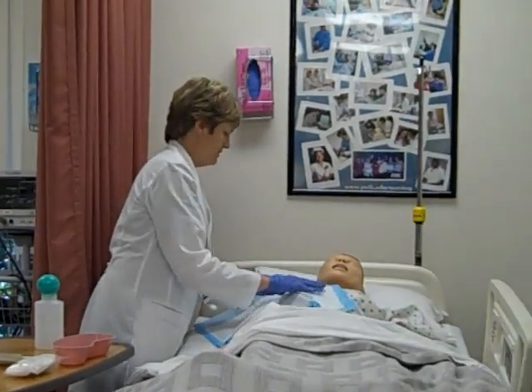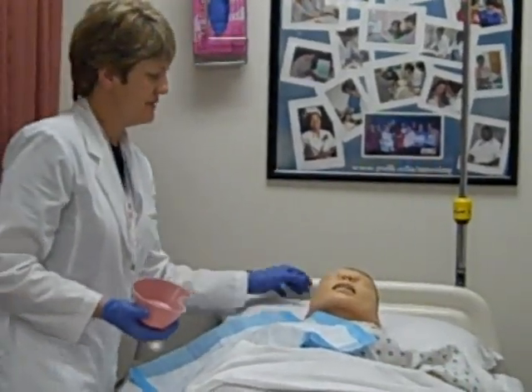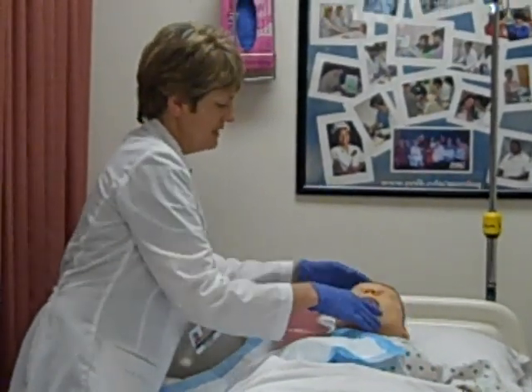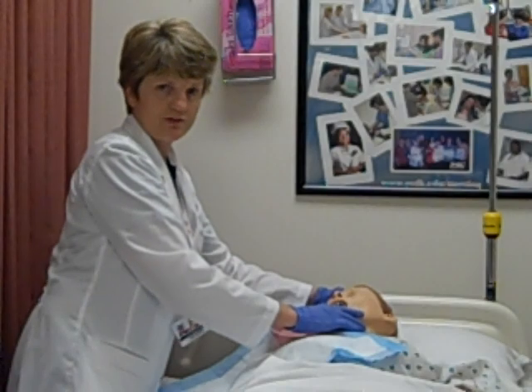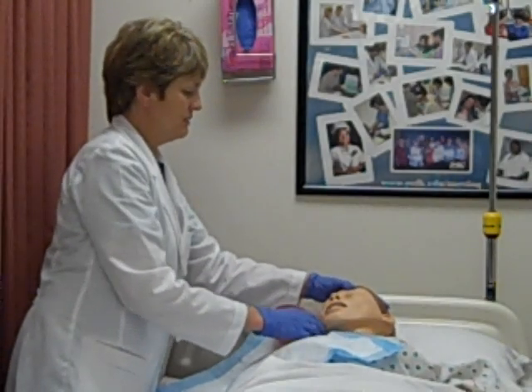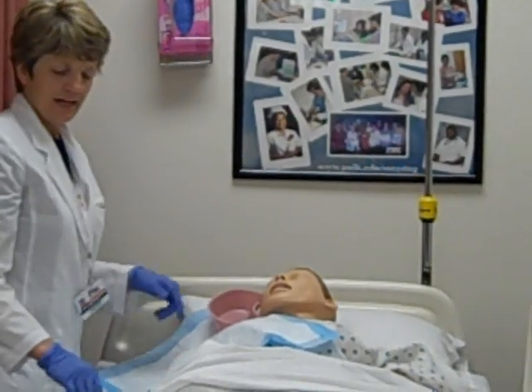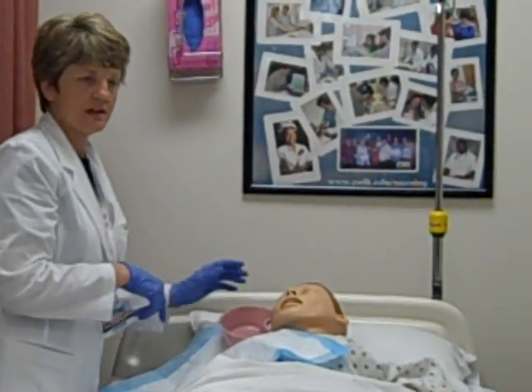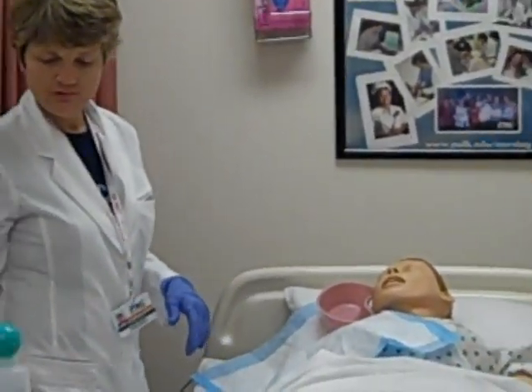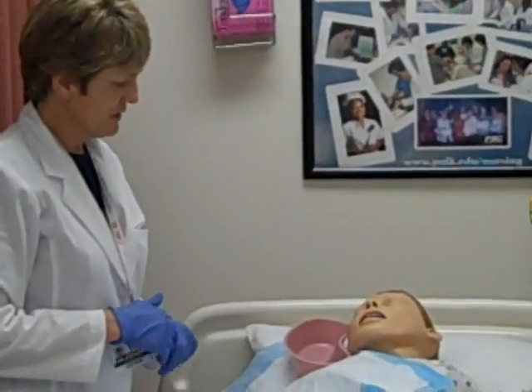I'm going to go ahead and put a drape over my patient. The patient has the head of the bed up about 20 degrees, which is sufficient. Because I'm irrigating the right eye, I'm going to have the patient turn their head to their right so the irrigating solution will flow downward. If the patient can, they can go ahead and hold the basin themselves. At this point, I'm going to do a small assessment of the eye — just making sure I'm looking at it before I'm irrigating it.